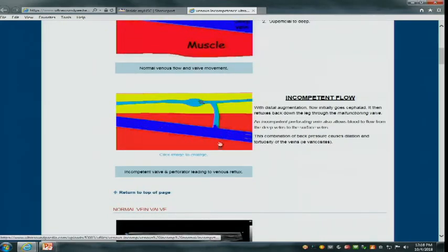There's no question here. All right, let's go to what would be abnormal. Abnormal would be, number one, if blood from the deep venous system is allowed to flow upward towards the superficial venous system. That is a problem. The second problem would be if blood within the superficial venous system is allowed to flow back, from cephalad to caudad, that's wrong. If flow is from deep to superficial, that is wrong. So we've established what's normal and what's abnormal. Both conditions, if blood is flowing from the deep venous system to the superficial venous system, challenge the superficial venous system.